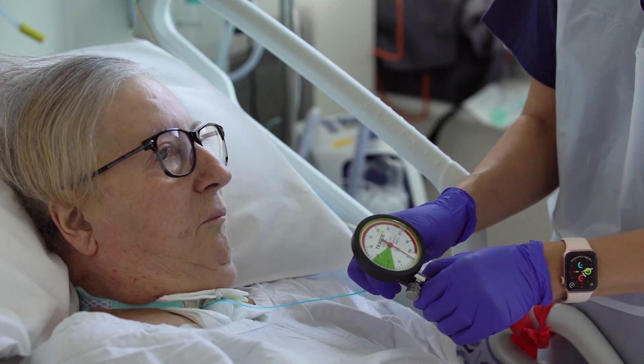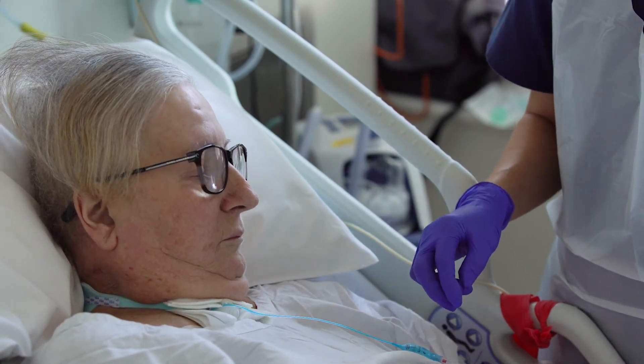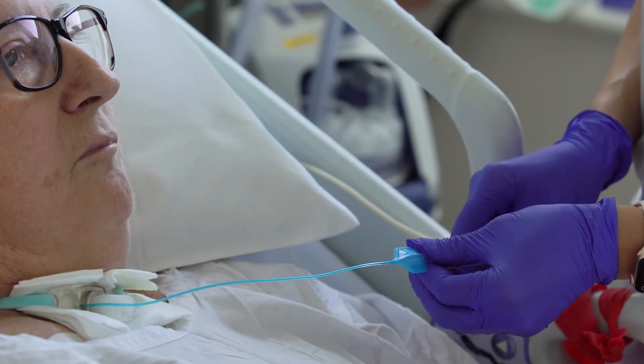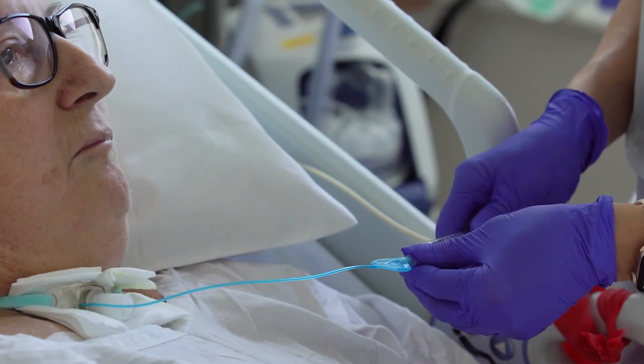Do not leave the manometer connected to the pilot line for a prolonged period as air will leak out of the cuff. If the pressure is not at the desired range, use a 10ml syringe to inflate or deflate the cuff by 0.5 to 1ml of air at a time before checking the pressure again with the manometer.